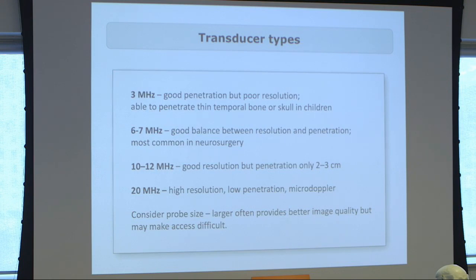Now, generally, the lower the frequency of your probe, the better the penetration into the tissue is, but the lower your resolution, axial and lateral resolution, is going to wind up being. The higher the frequency that you're working with, the better your resolution, but the lower the penetration into the tissue.